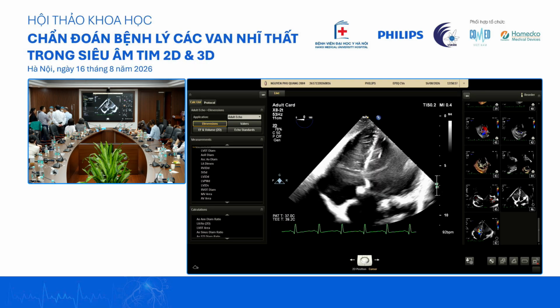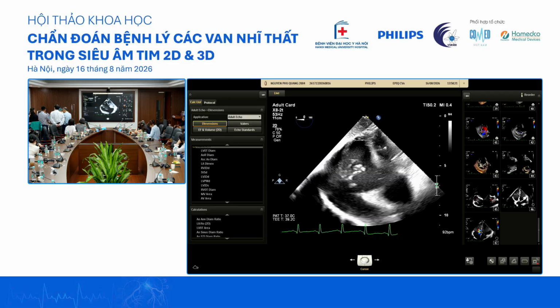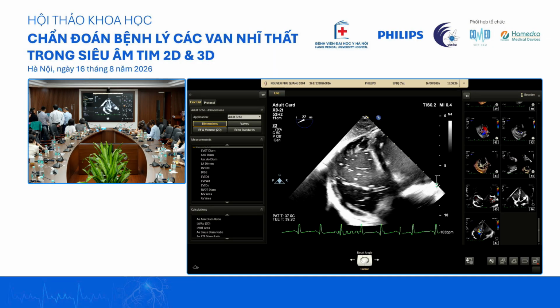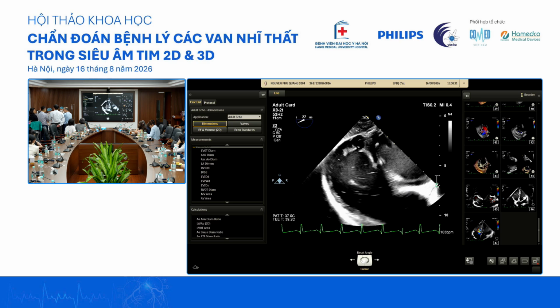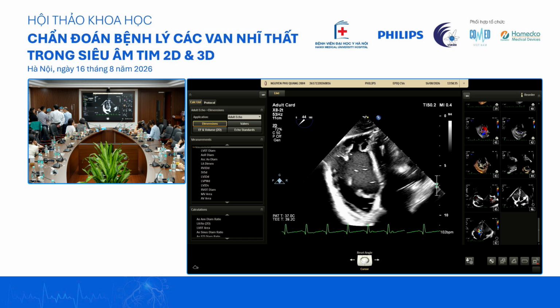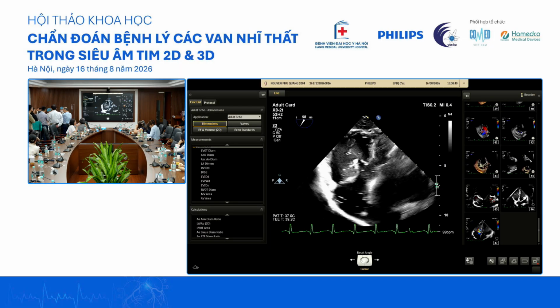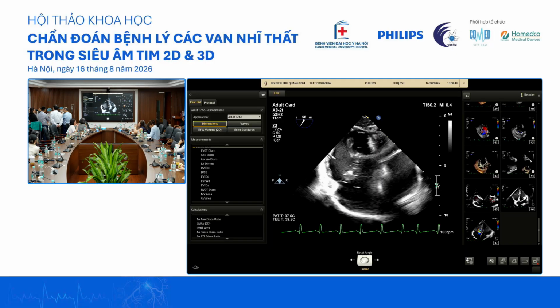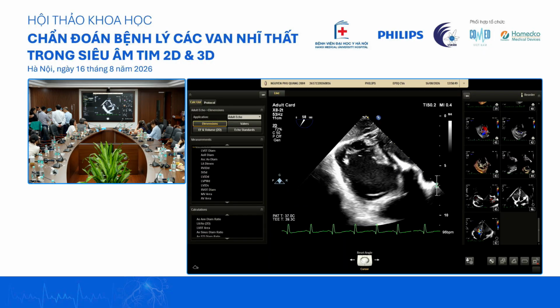Can you do a short axis deep transgastric short axis view? Almost, the last 1 minute. Short should be 80 to 90, right? 80 to 90. You can start with 0 also. Yeah, but it didn't show. 20 to 60, septal on the top, anterior and posterior. Yeah, this one is back to the 4. Yeah, we're not deep yet. A bit deeper.